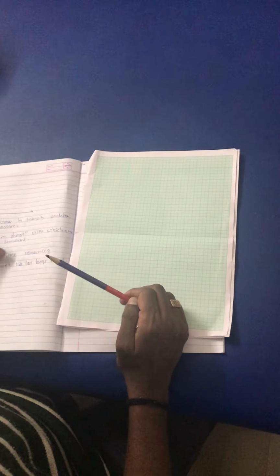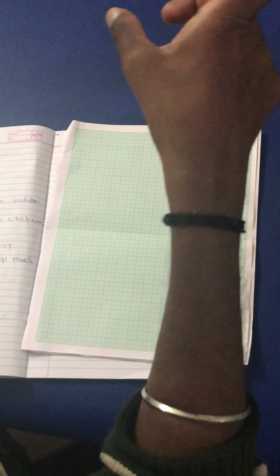Pencil. The blue is for the normal side, meaning the contralateral side, where I will be plotting an SD curve. If the right side is affected, I will actually do an SD curve for the left side tibialis anterior, because I want to know exactly how that curve is, what is the minimum intensity he requires, and how much. In the next lecture we will discuss rheobase, chronaxie and all that stuff.